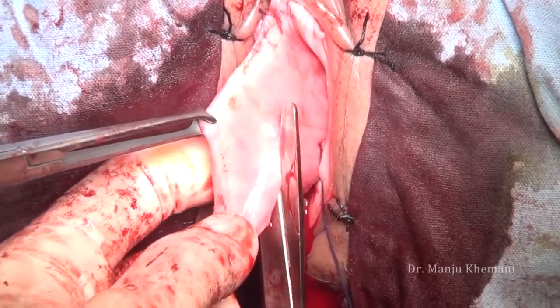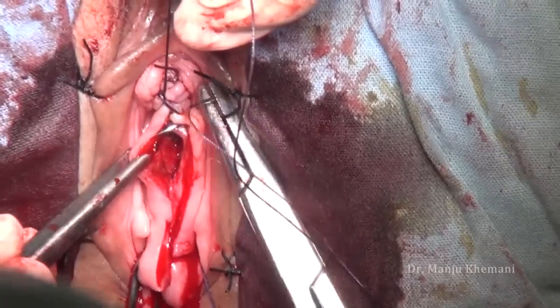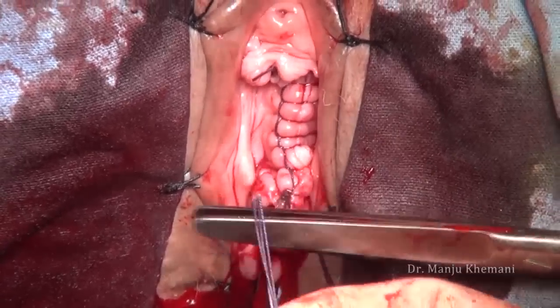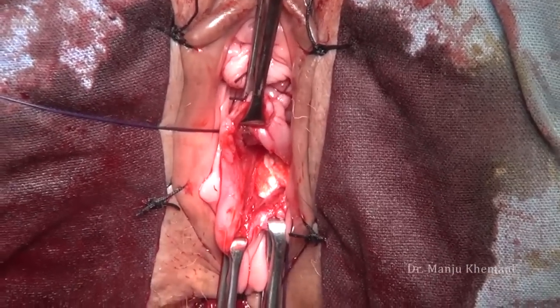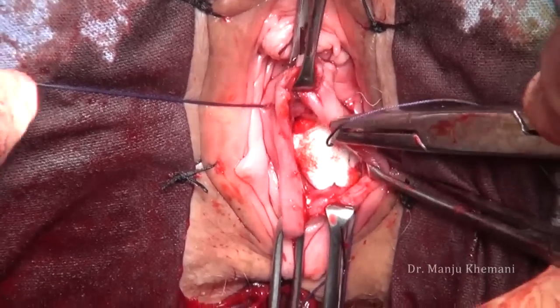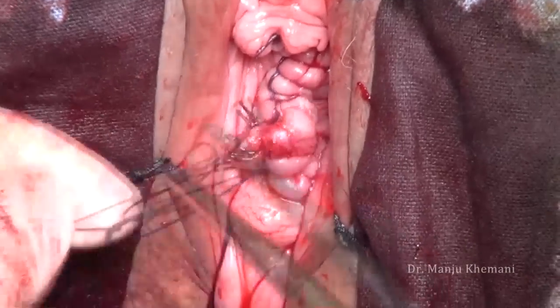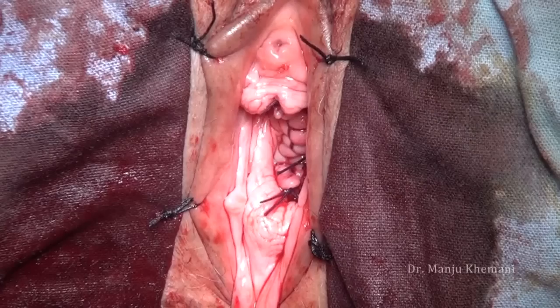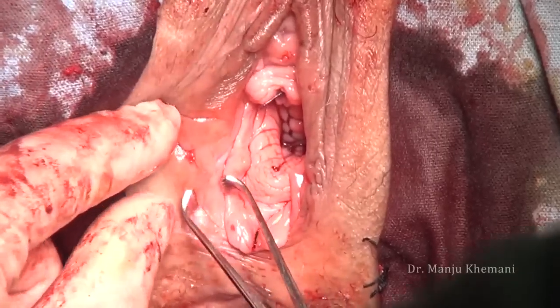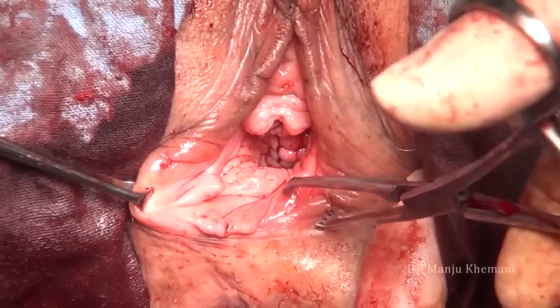Redundant vagina is cut and the vagina is closed with a continuous 1-0 Vicryl. In a young sexually active woman it is better to close with far-near-near sutures. I like to put Oxycel/packing in between the vaginal and bladder space as it helps with small bleeders. After vertical closure of the upper vagina, this is closed transversely. Once the vagina is closed it is pushed up, and the external culdoplasty sutures are tied — you can see the vagina has gone up. Now for the rectocele repair, the Ellis clamps have to be at the junction of skin and vagina. One can see how nicely the bladder has gone inside.